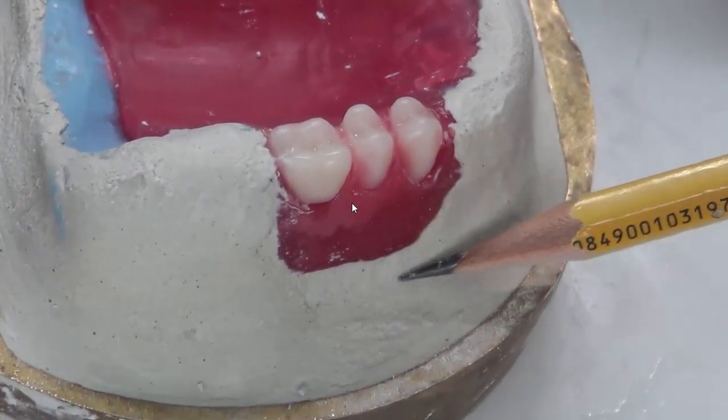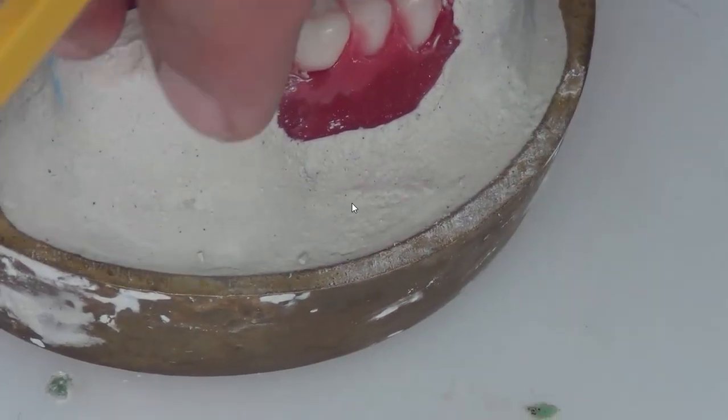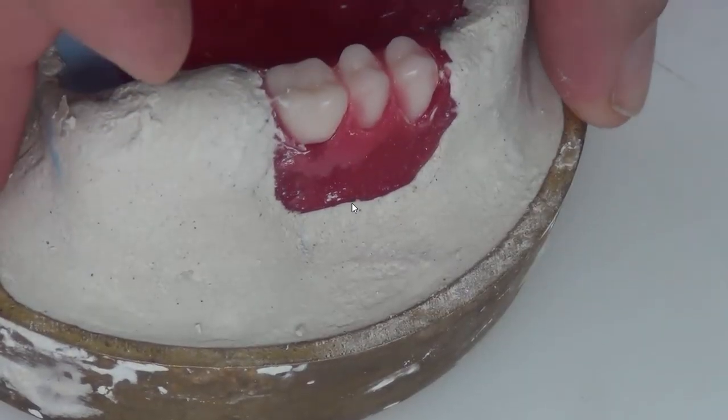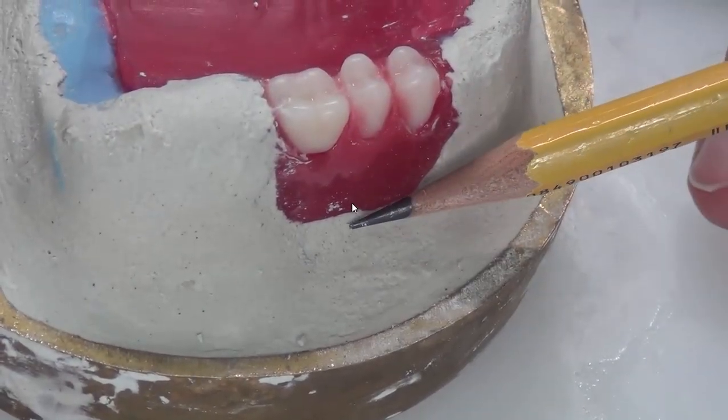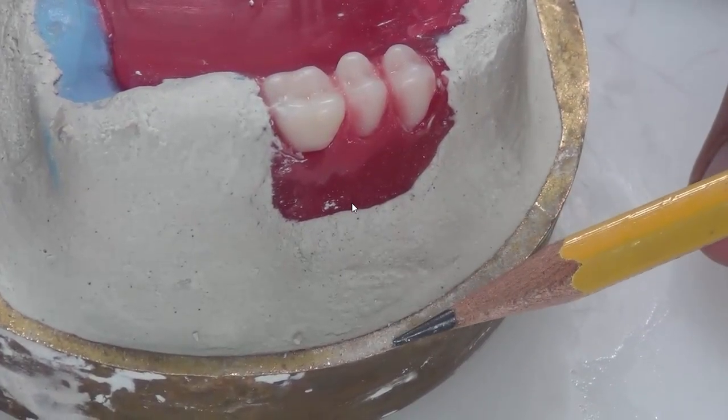I need to pay attention to the buckle, especially when I'm lowering the cast inside the flask. We told you that, how much do I lower it inside the flask? I keep lowering until the margin of the cast is level with the rim of the flask, okay?